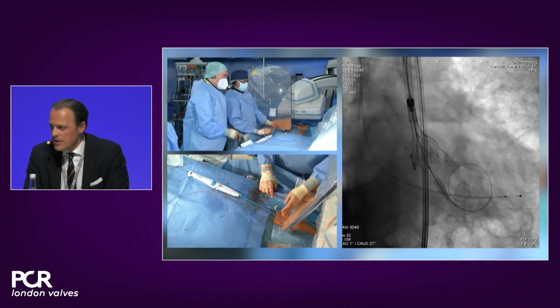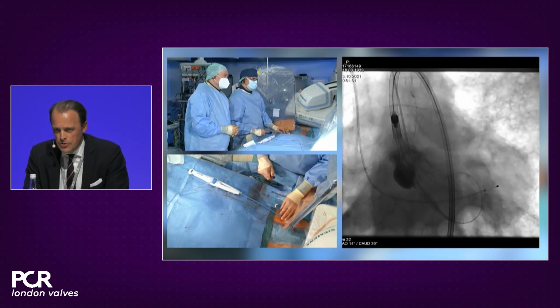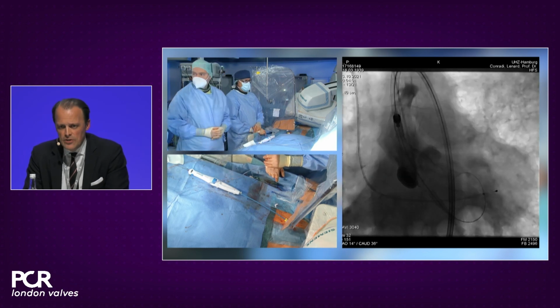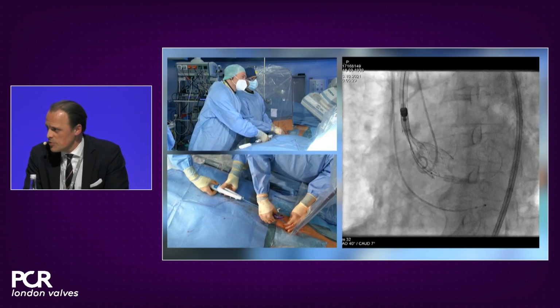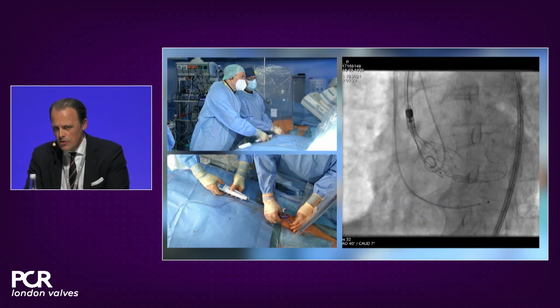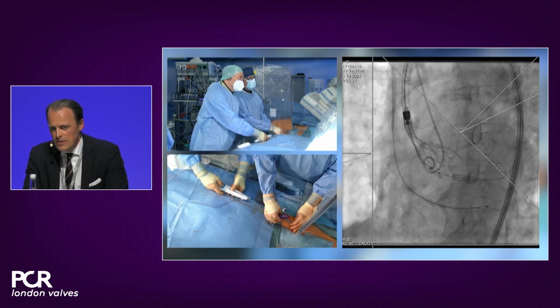This is the first angio in the cusp overlap. I like to perpendicularize the stent in order to look at the left circumference of the annulus. And if we're confident here that the valve positioning is good, relax the wire a little bit, take all the pressure, all the tension out of the system, and very, very slowly deploy the valve. Release the outflow of the stent, take your time.